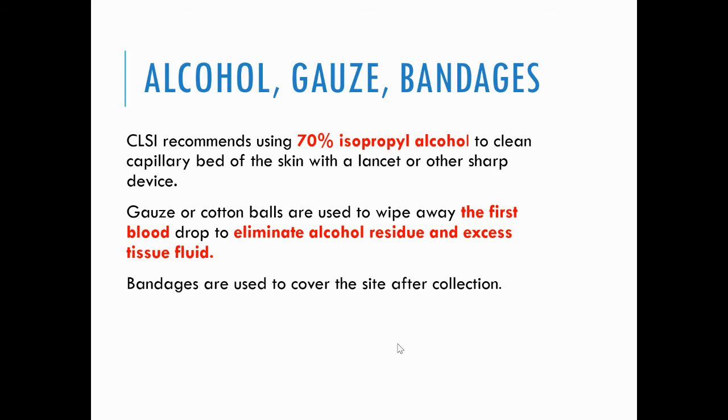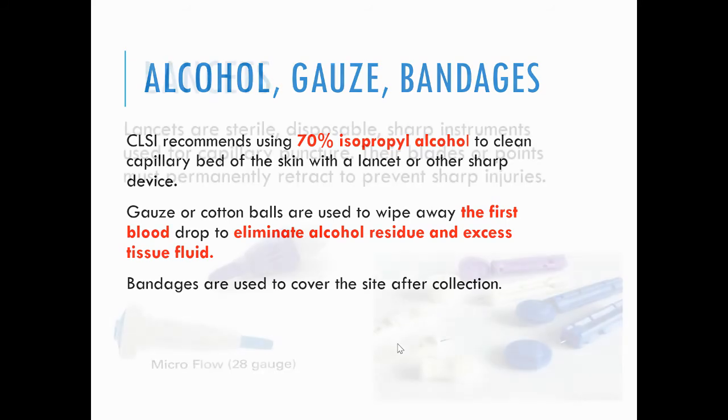excess tissue fluids. Okay, so first, nato nga puncture, ang napagidira kay ang mga tissue fluids nga present sa itong blood sample. And also, mga residue sa mga alcohol nga ato ang gi-apply kato nag-clean sa area. And also, bandages are used to cover the site after collection.